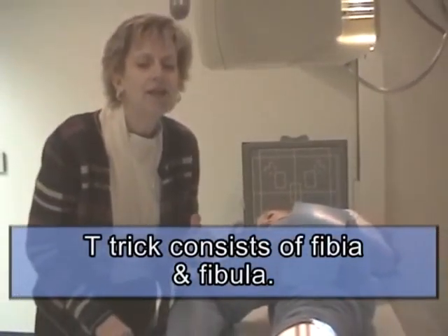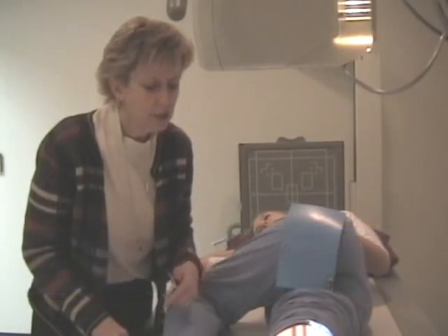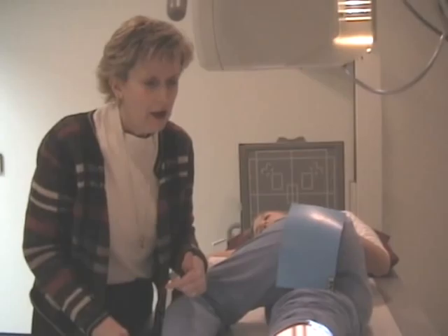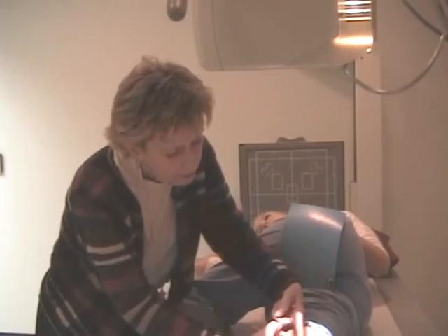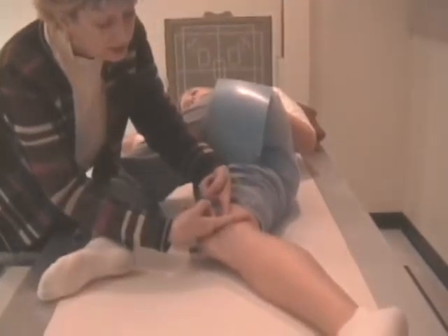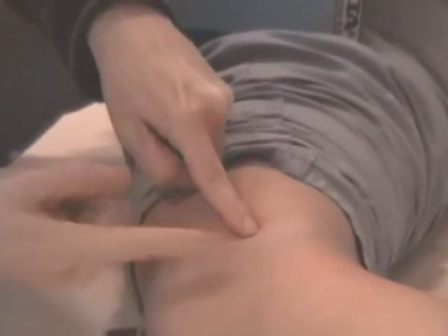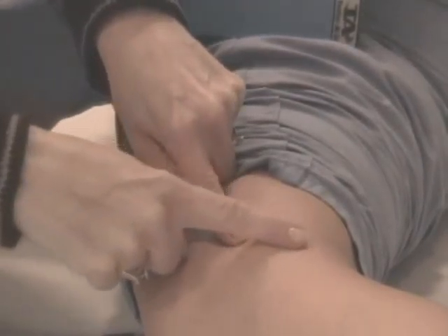Now I want to re-emphasize that the T trick is with the tibia and fibula. It's not with the femur, and many students understand the T trick, but they forget which bone it's meant to be with. If you make a T with the femur, and where the cross point is, see, you're actually going to be up on the femur, not into the joint space. You can actually see the joint space right there. Okay. We're going to pause for just a second now and get something else set up for you.